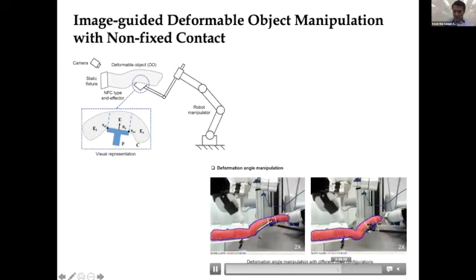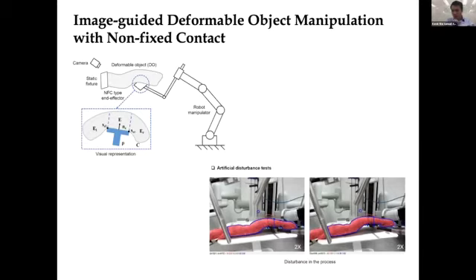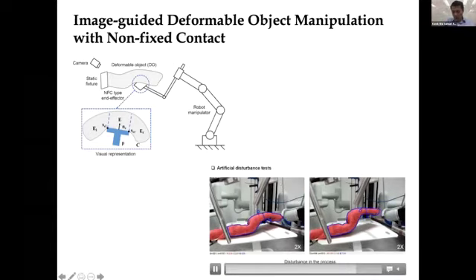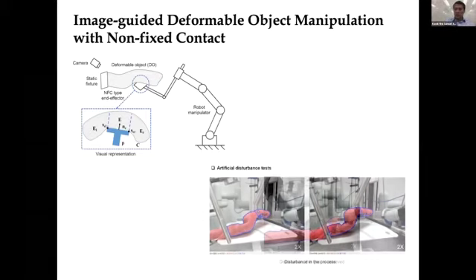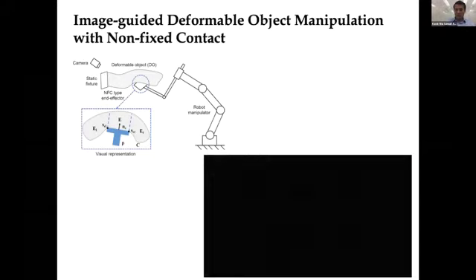Yes, here. During the autonomous control, even if you apply some mechanical disturbance, for example, if you are manipulating the organ and something moves around, the autonomous control can still remain stable and push the green point to the circle to make sure we reach the target position. Imagine one day when you are doing surgery, one hand is autonomous, and the other hand is doing operations driven by surgeons, so you can have an autonomous helper to do organ retraction.